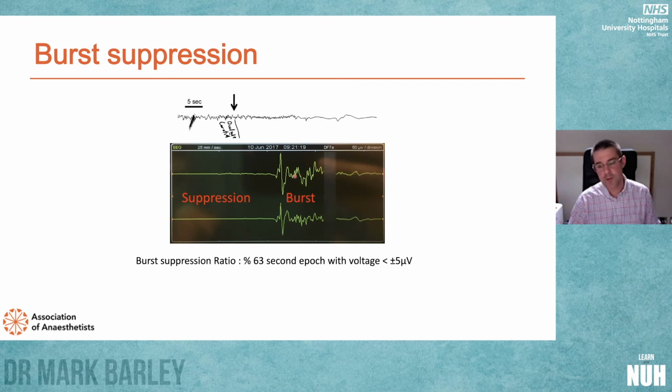And this is the thalamus desperately trying to kickstart the cortex back into life, if you like. These bursts are agent-specific in their morphology. Propofol's bursts are shorter and lower amplitude and require less ATP to produce than isoflurane. Isoflurane's are very steep and sharp and quite prolonged, which is due to the small NMDA receptor effect that isoflurane has.